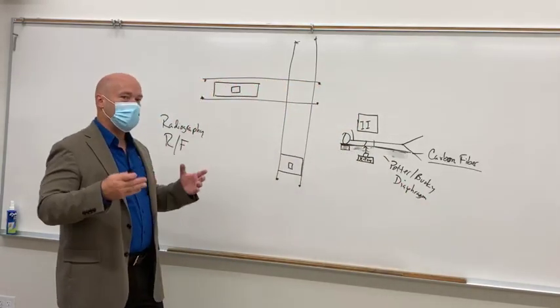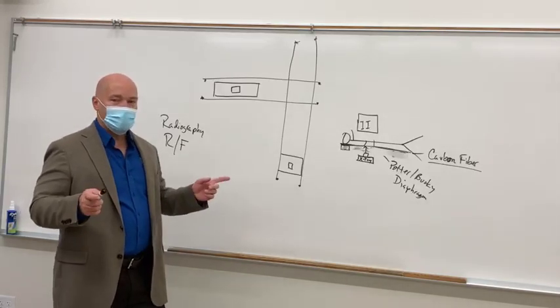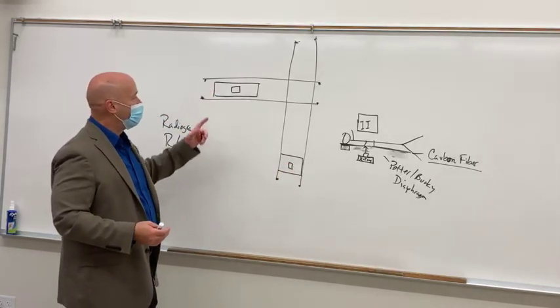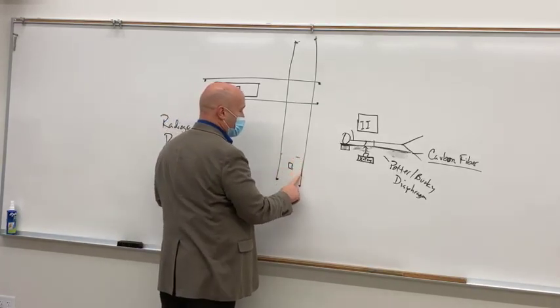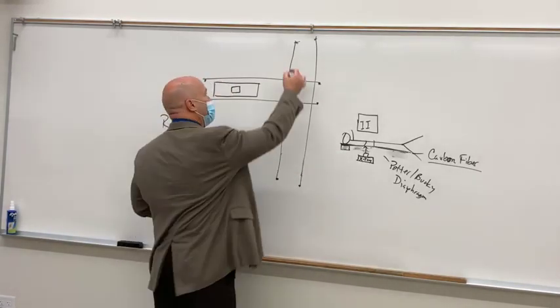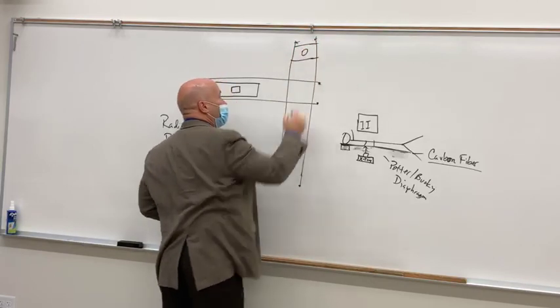So if it's big and it's heavy and it moves relatively quickly, one thing that you've got to get used to in your room setup is where you're going to put that, because it's got to be out of the way of the fluoro tower. So in most cases, whenever you're setting up a fluoro room, two things you need to do is plan where you're going to put the bucky and plan where you're going to put the overhead crane assembly x-ray tube.